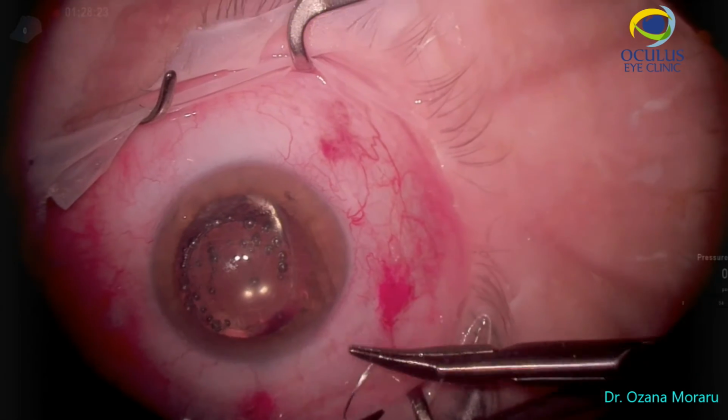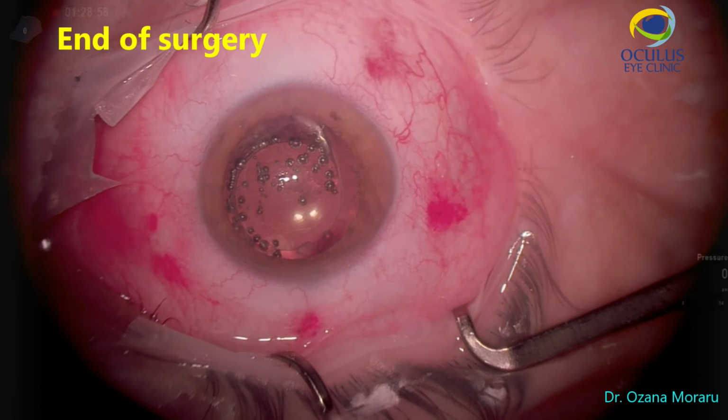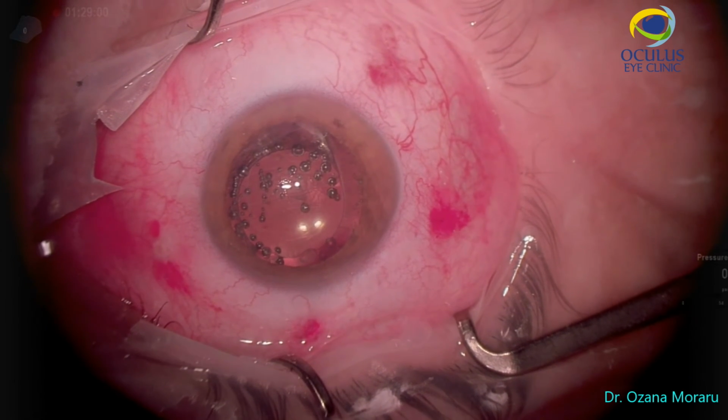And then we injected silicone oil. We checked the IOP. We removed the trocars, and this is the end of the surgery.